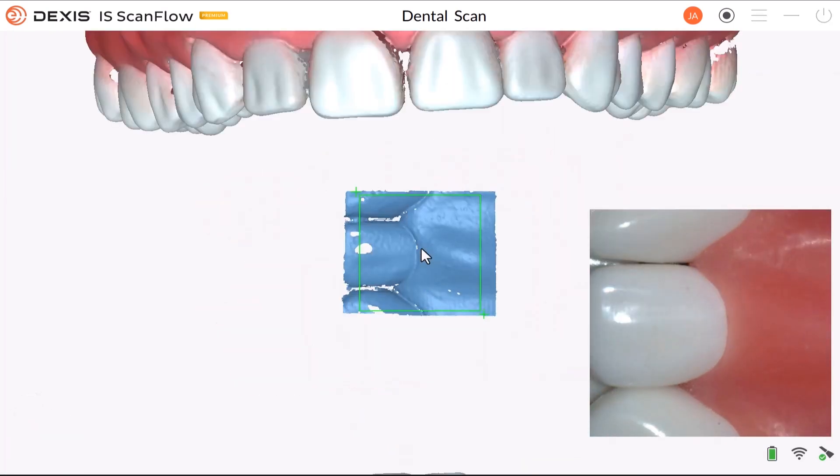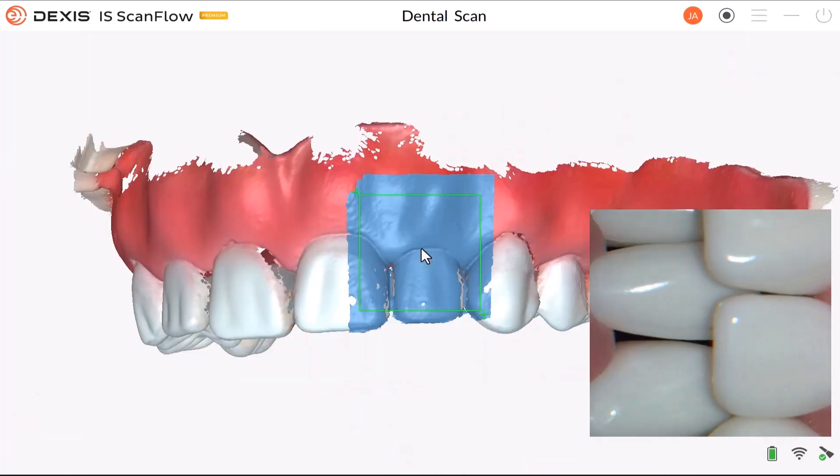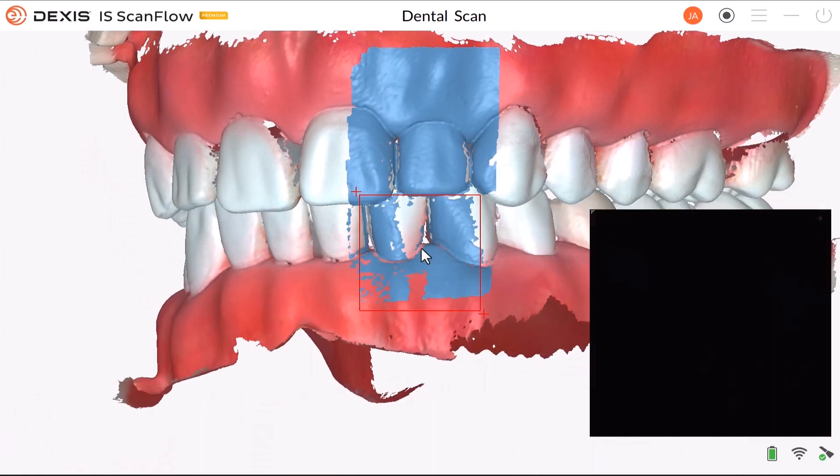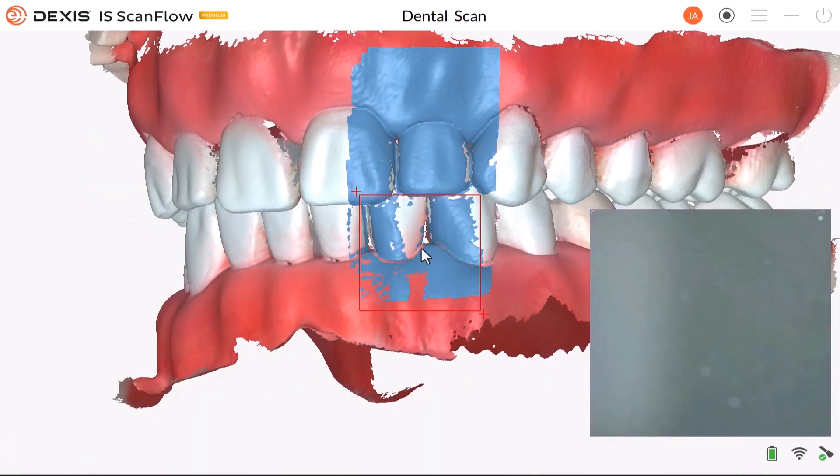Now, take another scan of the cut result. Scan the upper jaw.